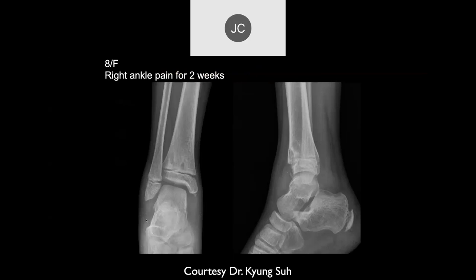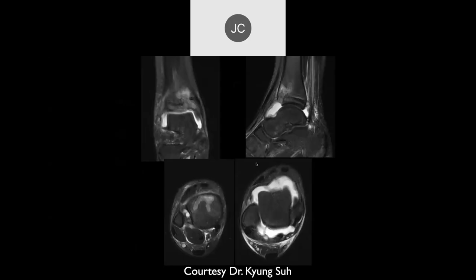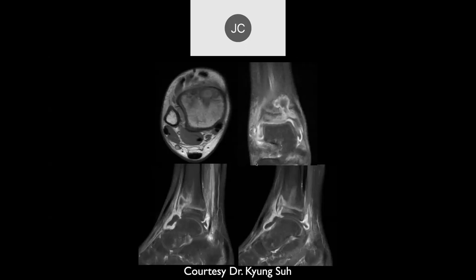Two weeks of right ankle pain. There's a small lucency anteriorly in the metaphysis of the tibia. On MRI with contrast, there appears to be a Brodie's abscess going into the epiphysis, possibly even an infected joint. This is another tuberculosis osteomyelitis case.